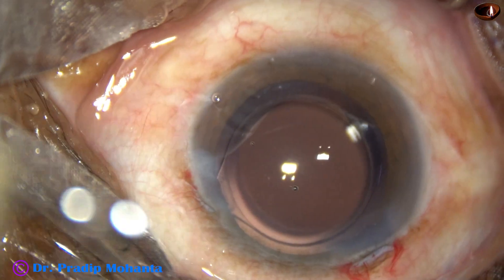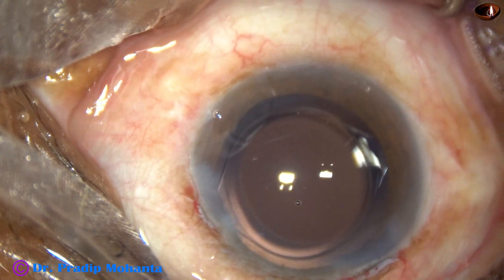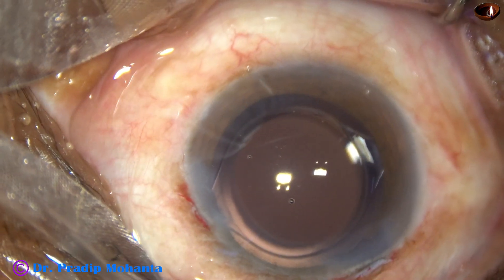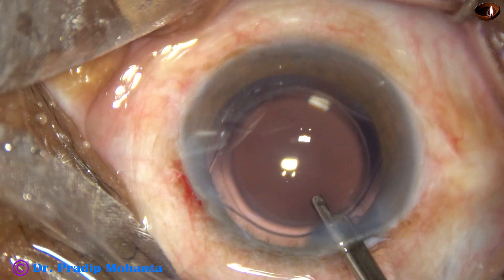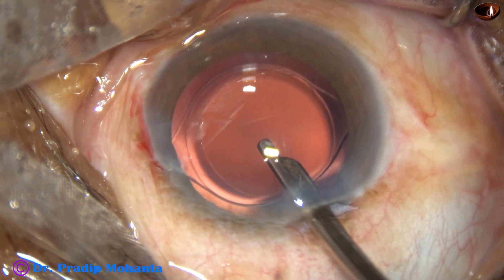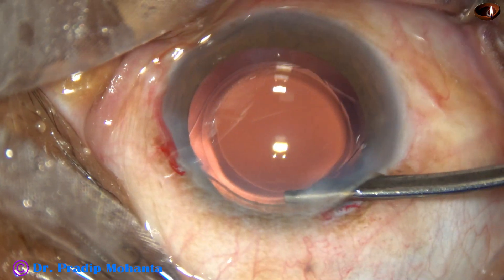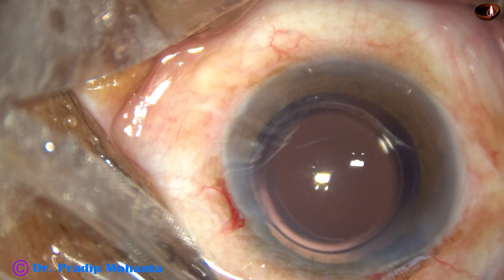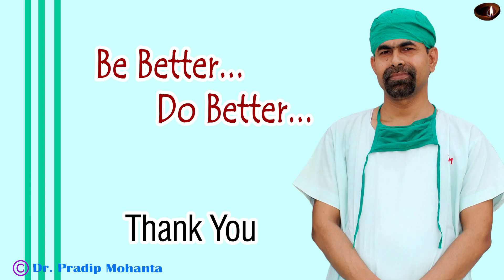Moxifloxacin has been applied. The side port is closed by hydrating the corneal stroma. A final lavage of the anterior chamber is done — this is very important. If we do this, the incidence of endophthalmitis will be unknown in your practice. Let pure BSS be there at the conclusion of the surgery, and check the integrity of the wounds. No leakage should be there.